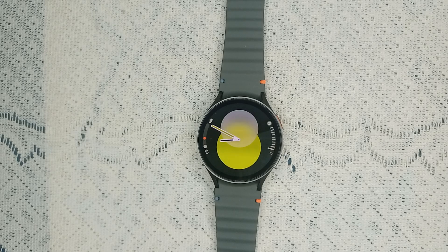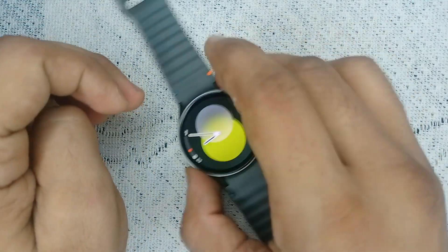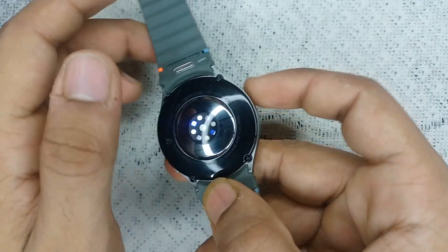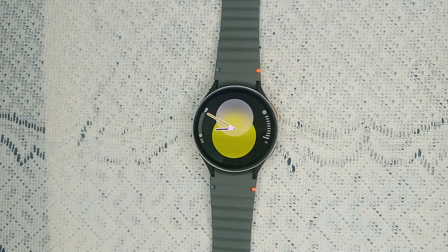If restarting does not resolve your issue, it may be a sensor functionality problem. When wearing your watch, make sure it is not too tight or too loose on your wrist, because if it is, the sensors will not be able to read your wrist correctly.